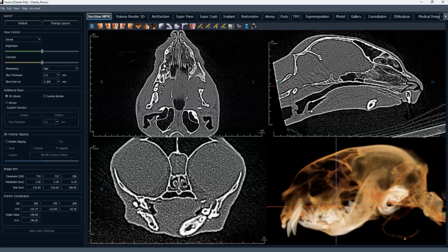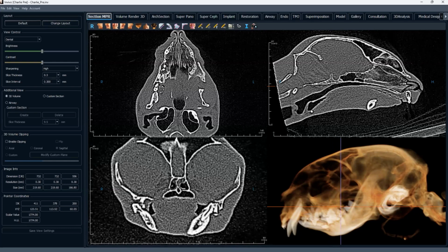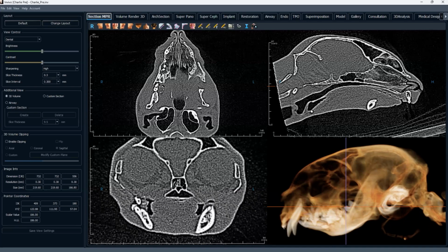So a couple other things that are germane to what we want to do. We know we want to take out this right mandible because we think the left mandible, or the left TMJ, is functional. And if we can remove a portion of the right mandible, we should be able to get his mouth open and he should be functional, which means we're going to have to cut through the right mandible in the caudal area. And normally there's an artery in there, a mandibular artery.